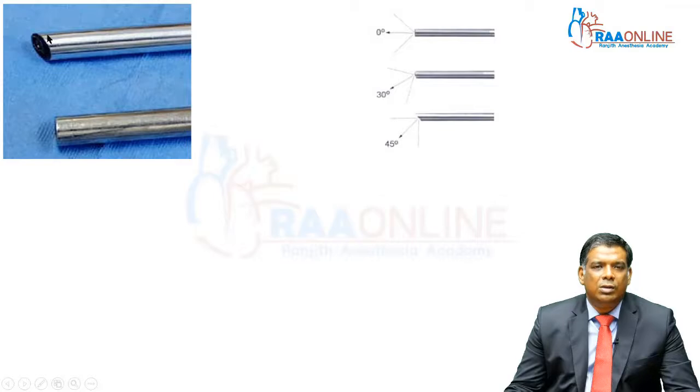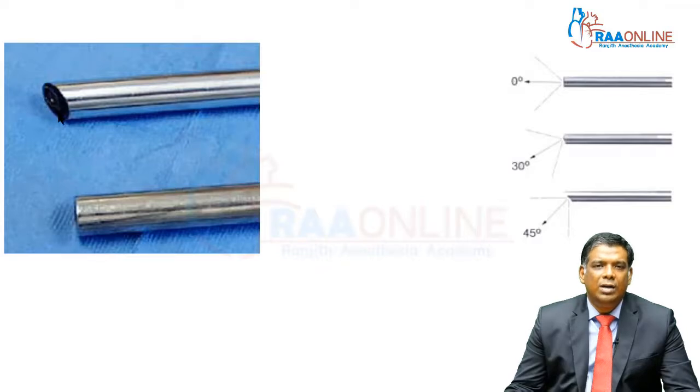Less commonly used, but more effective if you're going to be doing a little more advanced surgery, is the 30-degree scope, because this gives you a wider range of vision, and depending on how you turn it, you'll be able to see better parts of it. It theoretically also gives you a better 2-dimensional view compared to a 0-degree scope.